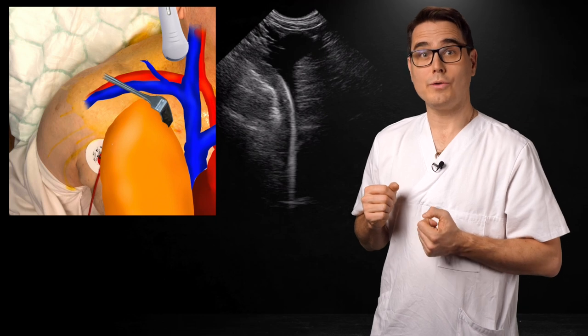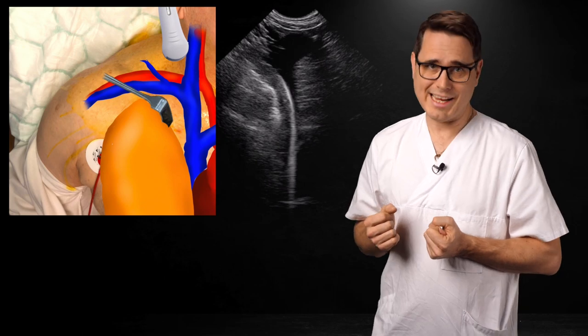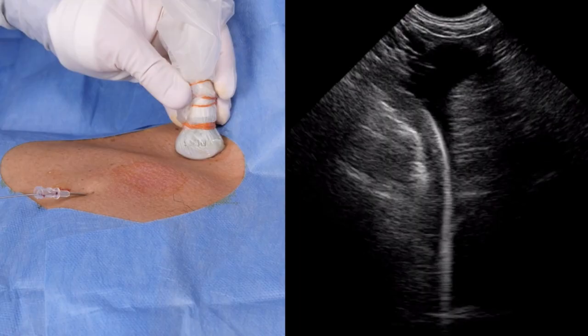In this picture, we also see a glorious visualization of a guide wire descending towards the right atrium. Here's the footage from the actual cannulation.